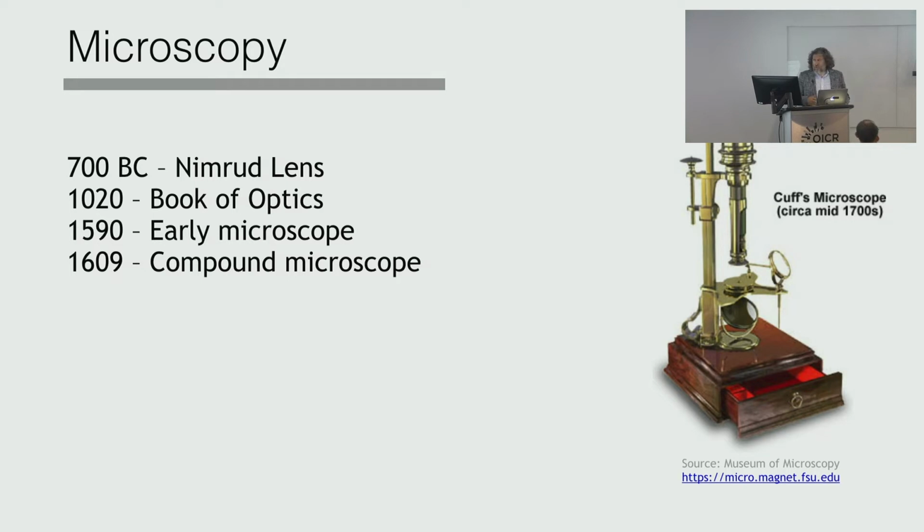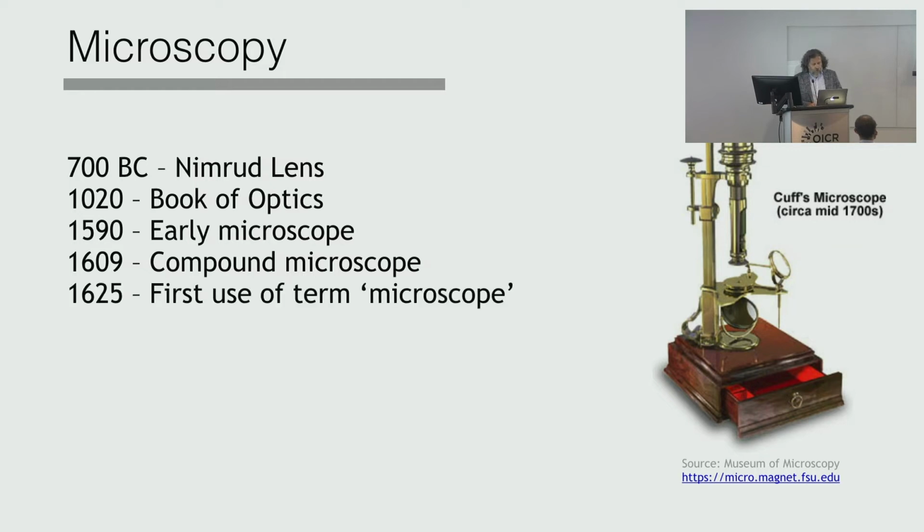This is one of the reasons, I think, that it has been neglected in literature: why are we not going digital faster? I think that some of it has historical roots. We have been using microscopes for 400 years, so it's really tough to put it aside. And the icon of the microscope has become the symbol of science. So you take that away from a pathologist and you give them a monitor. That's not a replacement. But there is no literature work on that.